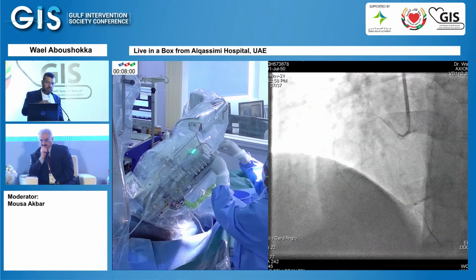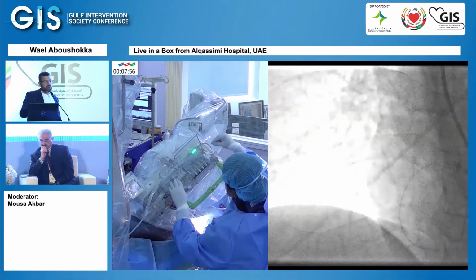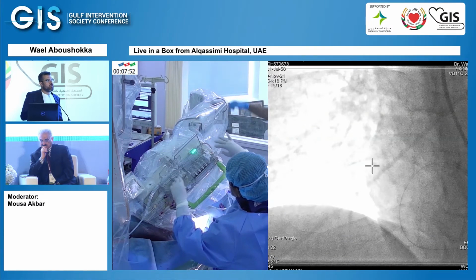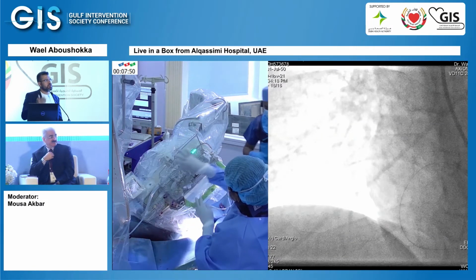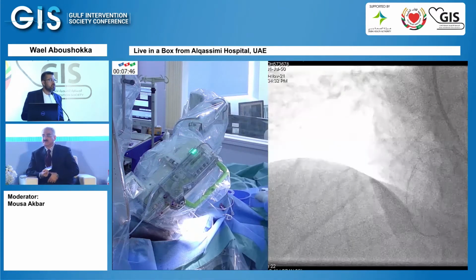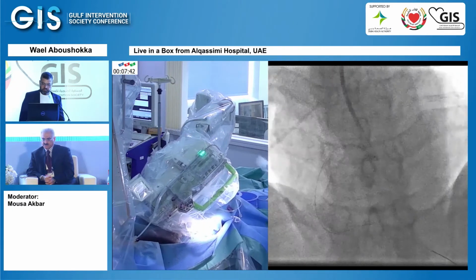So we have two tracks. Okay, can you center? One for the wire you use, and another parking track. You can put whatever you want in this parking track, if you want to use two balloons, two wires. Can you center? Okay.